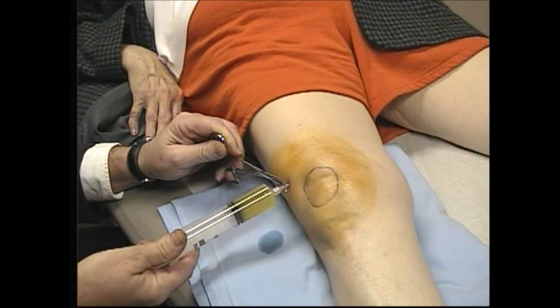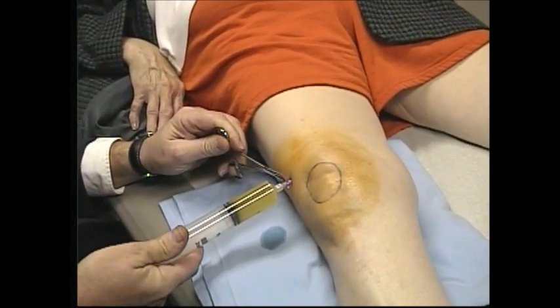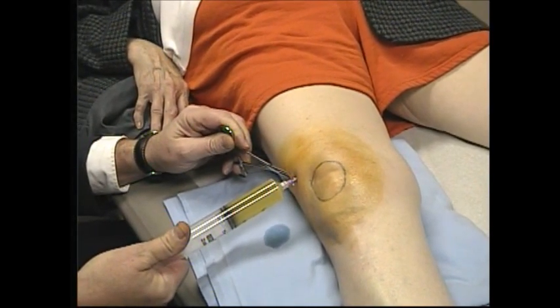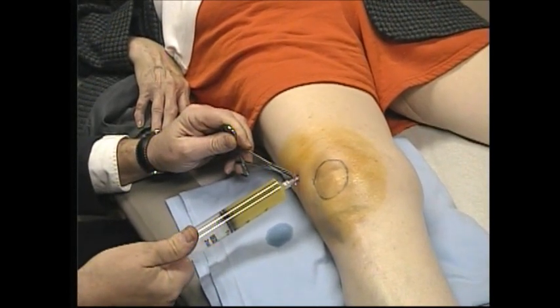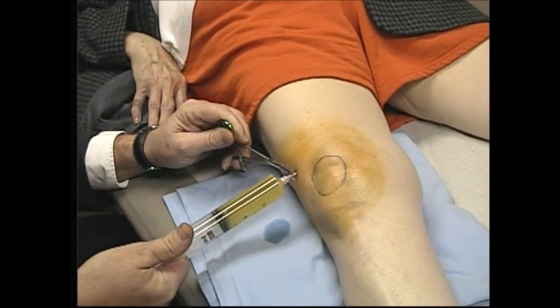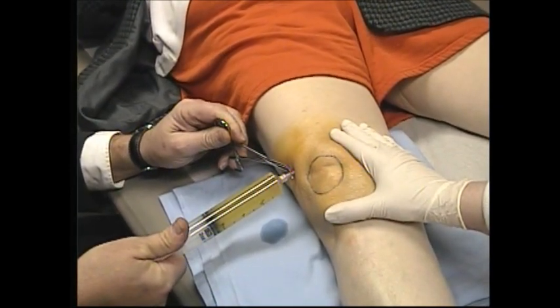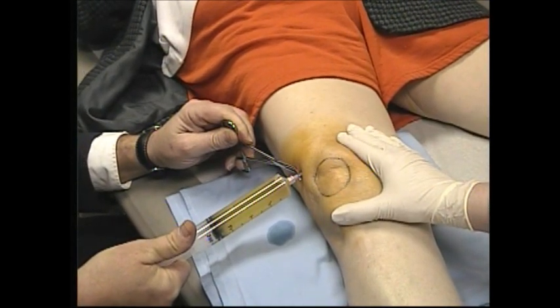Are you having any pain while I'm doing this? It hurts a little bit. The real key to not hurting a lot is just to have the pressure sort of steady and allow it to empty the knee. Go on the other side of Sharon and give me a little pressure over on that side just a little bit. If you just kind of compress the knee down a little bit, then you can get a little bit more fluid out — because it forces it over here where the needle is.